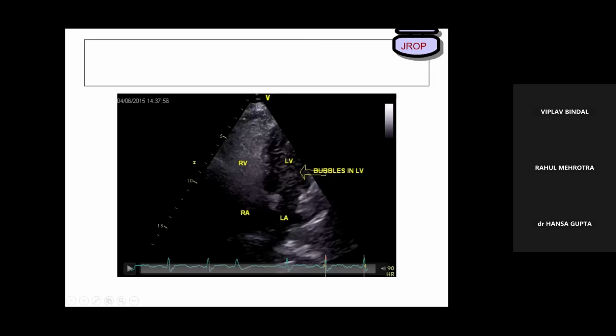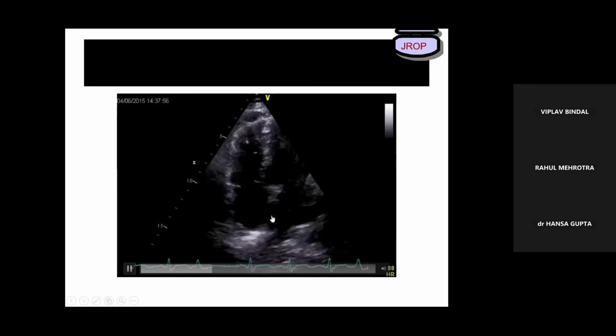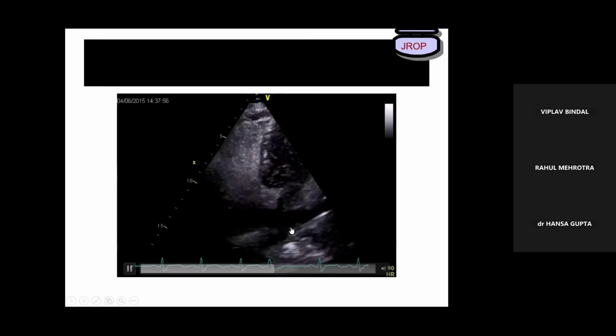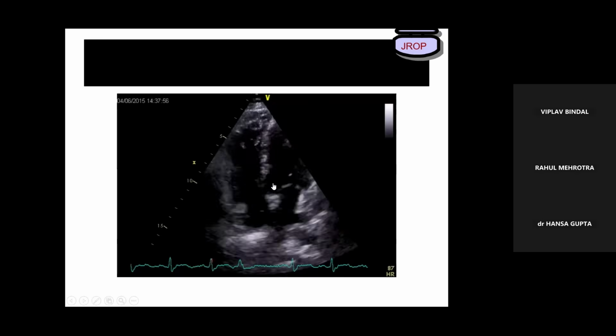Now you could see bubbles at a later stage. Now I'm going to show this slide again and try to stop where you start seeing bubbles coming out from this place. Filling defect, and suddenly the bubbles came. But we were not able to show where the bubbles came, and we have to stop the film in between to show the bubbles.